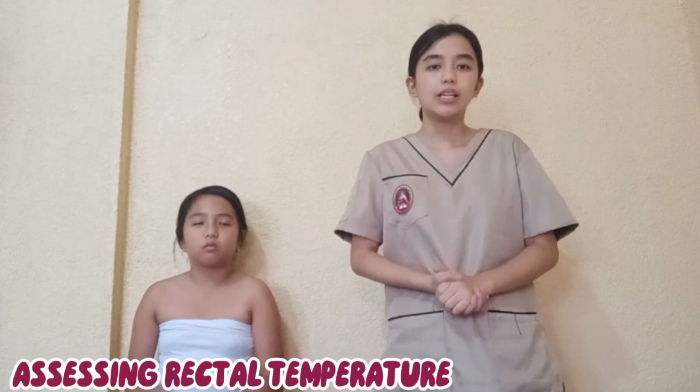Next, I will be assessing the rectal temperature. Same as the tympanic, I will cite only the procedures. The first thing to do is to adjust the bed to a comfortable working height, usually elbow height of the caregiver. Next, put on non-sterile gloves and then assist the patient to a side-lying position. After that, pull back the covers enough to expose only the buttocks and then remove the rectal probe from within the recording unit of the electronic thermometer.